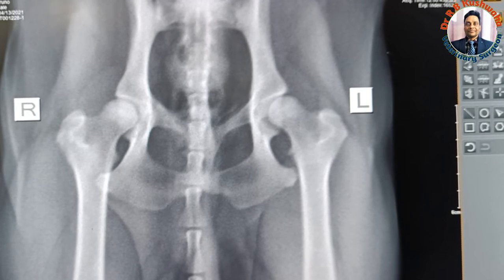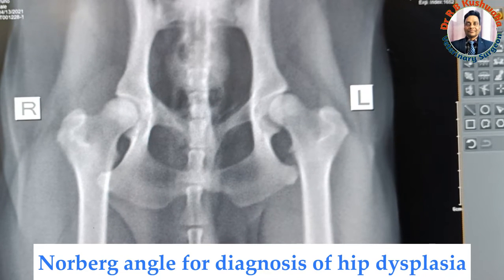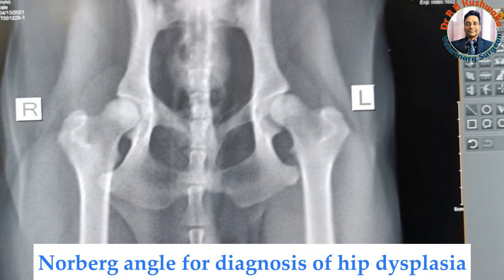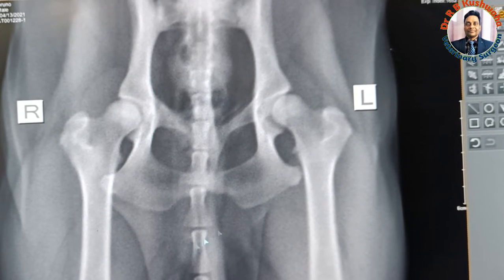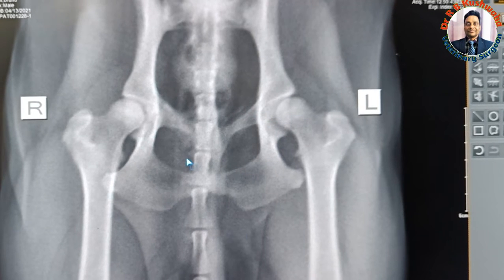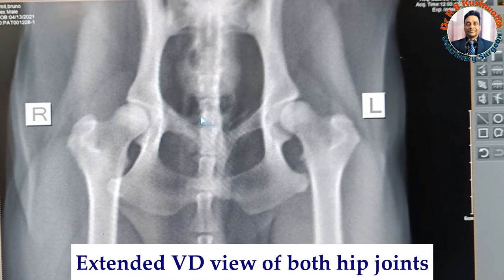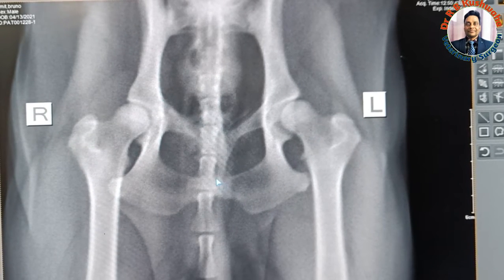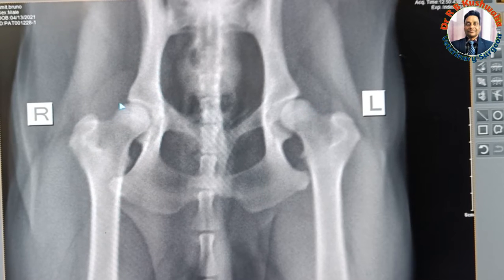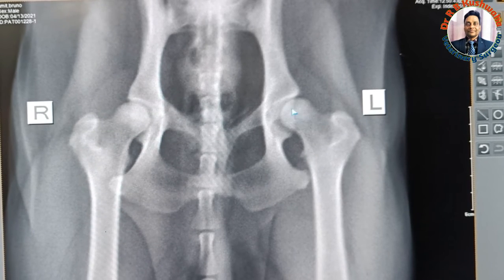Today I am going to demonstrate how to take the Norberg angle for the diagnosis of hip dysplasia in dogs. This is the extended ventrodorsal view of a one-year-old Golden Retriever dog showing the sign of hip dysplasia. We have taken the extended ventrodorsal view of both hip joints. Although the femoral head is looking within the acetabular cavity, particularly the right one, it is very difficult to say unless and until we take the Norberg's angle.